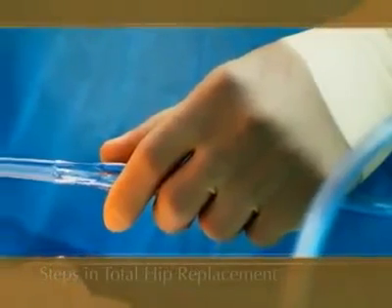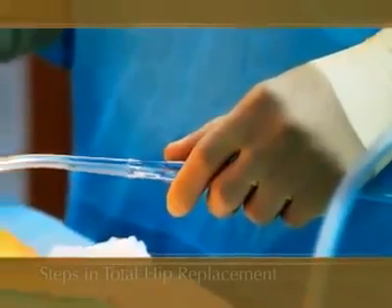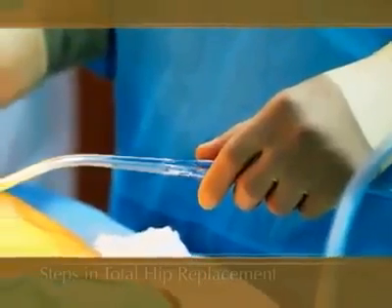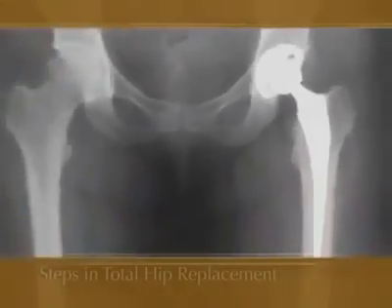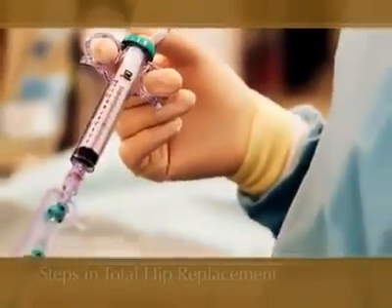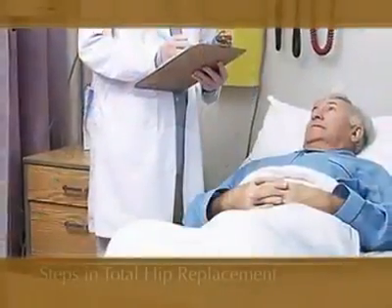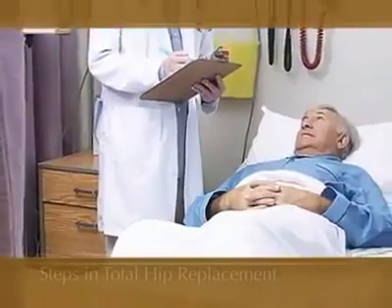Your physician will rinse out debris from the hip joint with sterile fluid, and then close the wound in layers with stitches and/or staples. A plastic drain may be placed in your hip and removed later. The purpose of the drain is to remove blood from the inside of the joint and tissues that might accumulate in the area after surgery. When you awaken from surgery, you will be in the recovery room.